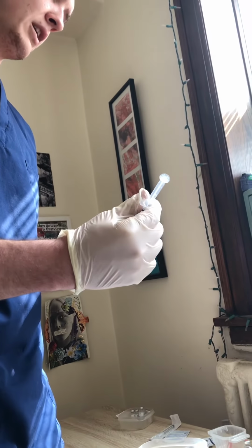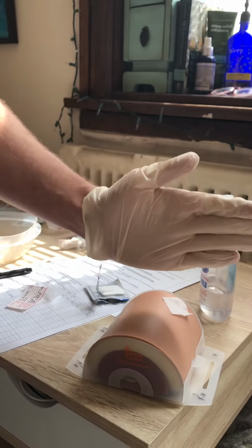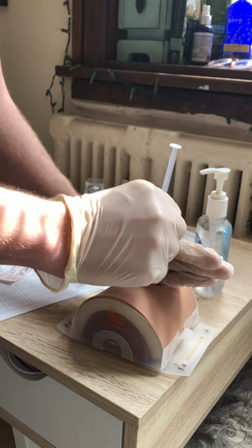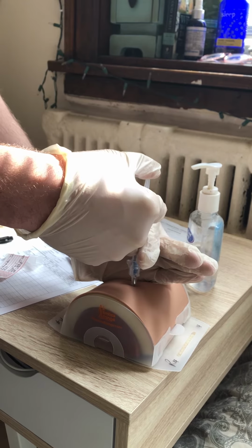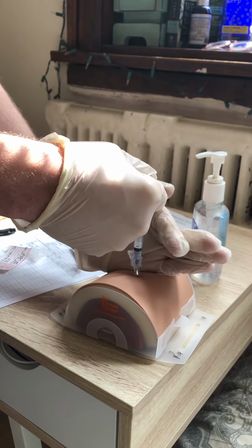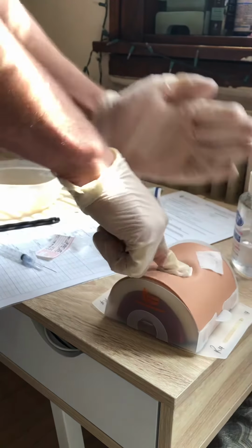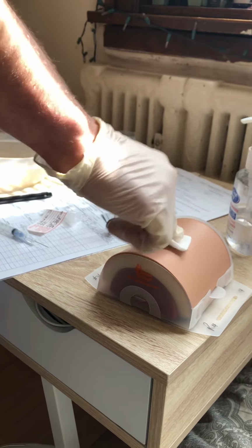So now I'm gonna do this. So I've already landmarked. So I'm gonna displace the tissue. So hand down like this, displace it, pull it out of the way, and then go straight in on a 90-degree angle. And to stabilize, slowly inject the medication. Okay, so I'm gonna leave it for a couple seconds, pull out gently, and I'm gonna quickly set that to the side without poking myself, and give the patient this to apply pressure to prevent any bruising.